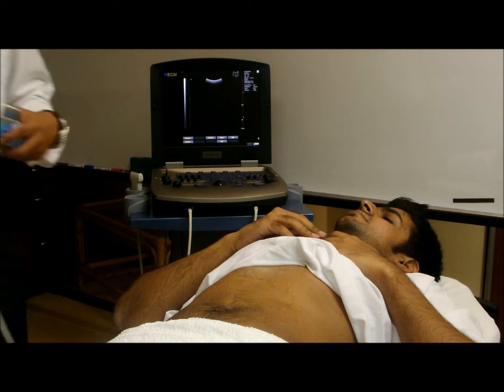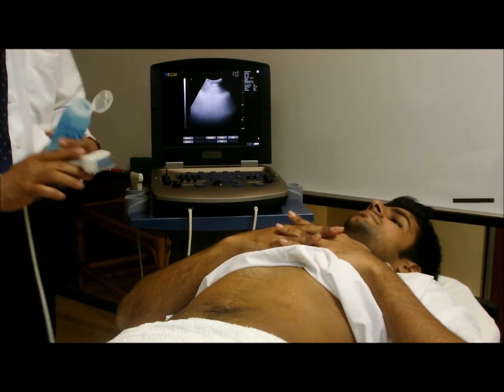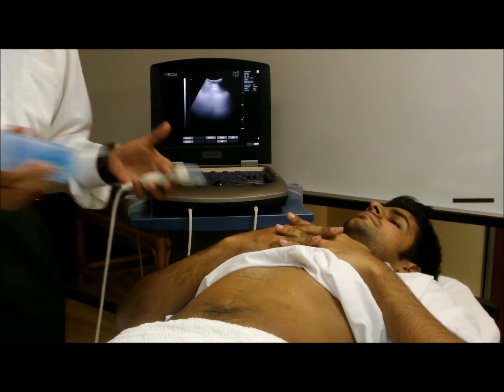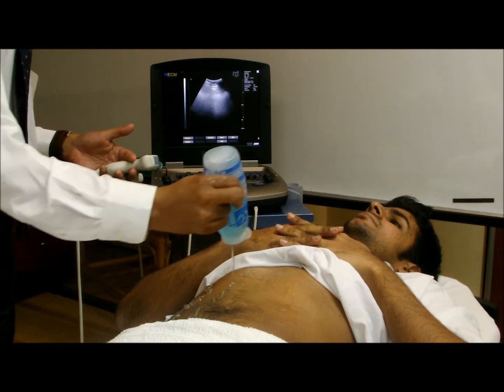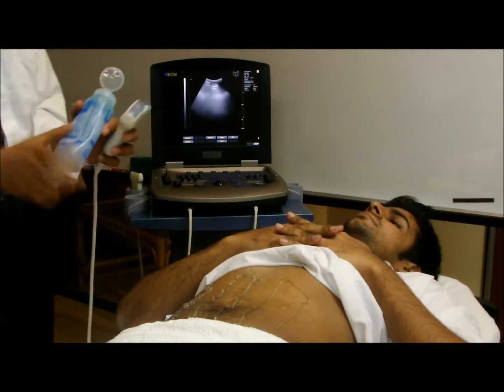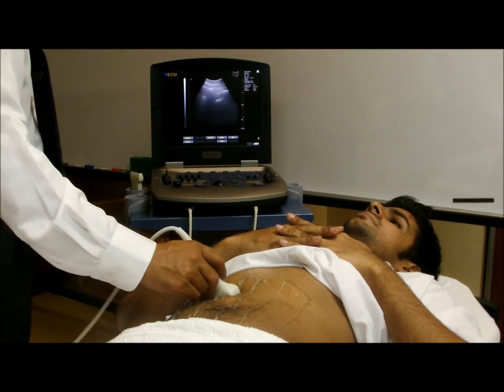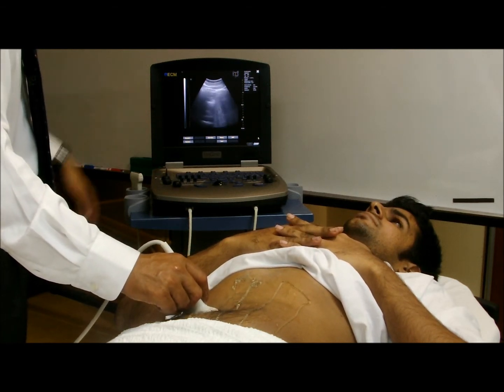You could also assess whether there's any small bowel obstruction, whereby you move like a lawnmower over the central part of the tummy. From here, down, up, down, like that. You can move your probe from here, and along the way you move it downwards, and take a look at the screen.